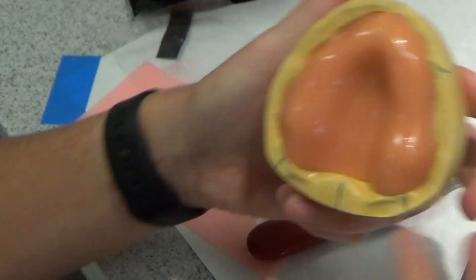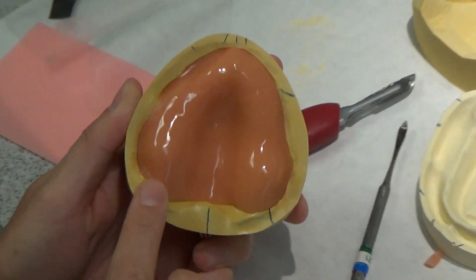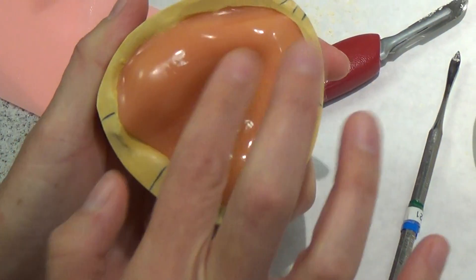And you should have something that looks like this. It's going through the hamular notch area here to the depth and the width of the vestibule everywhere else. It's nice and smooth, well adapted to the cast.